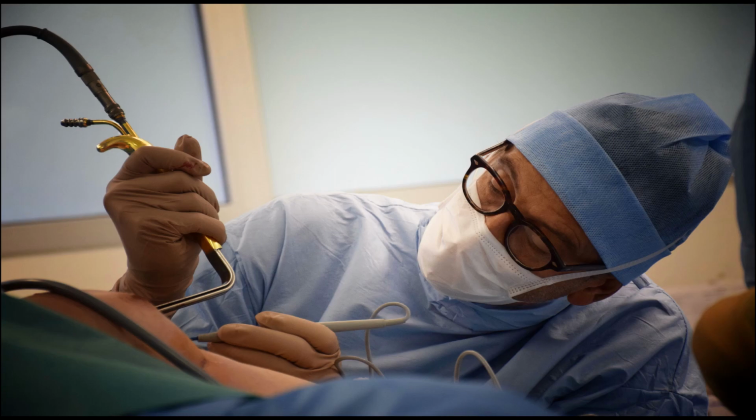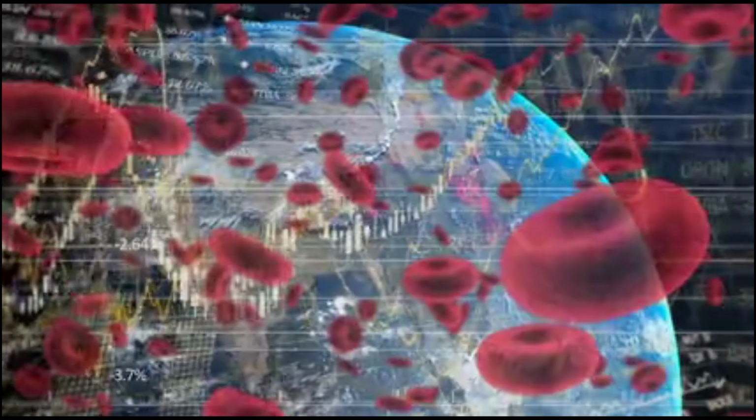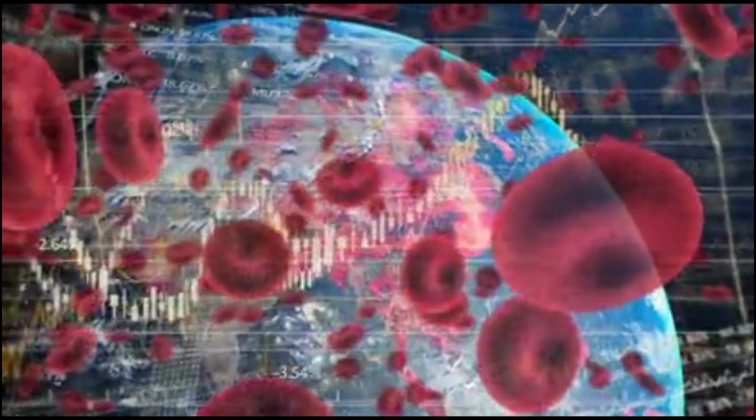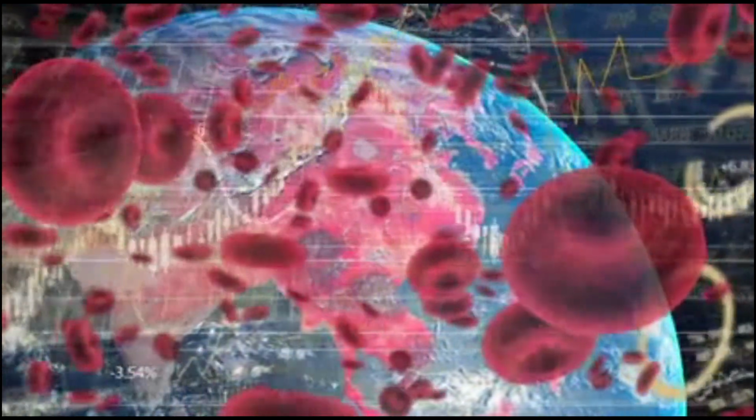So yeah, I guess the sound can go through the walls and cracks the calcium and plaque that's in the artery. So once the calcified plaque is cracked up by the sound waves, they place a metal coil. They call it a stent. It's a very small metal coil, and it expands, and that restores the blood flow. They say the procedure takes about an hour.